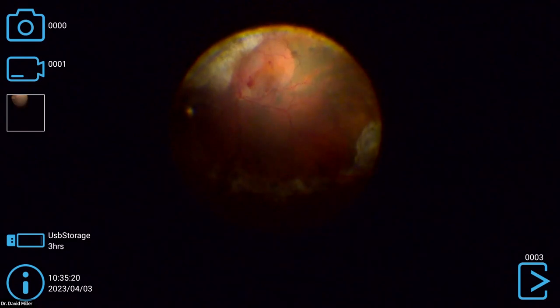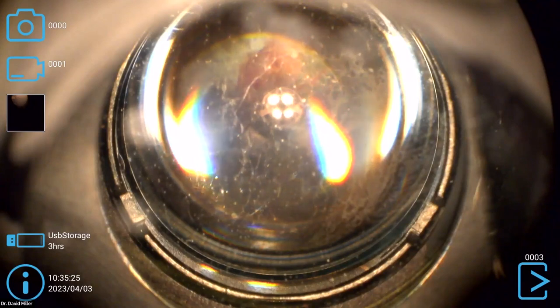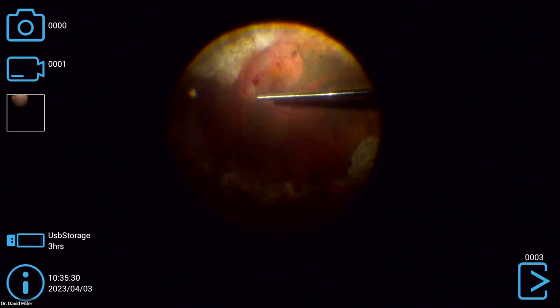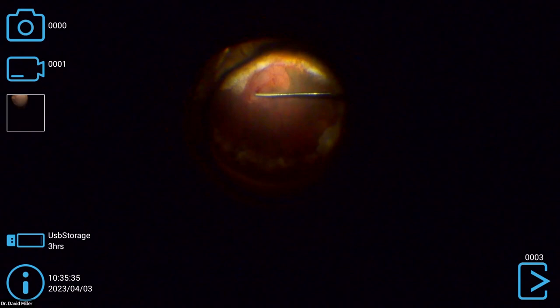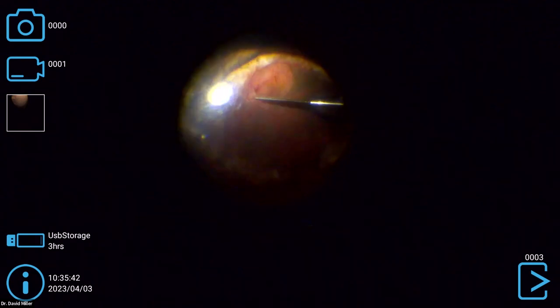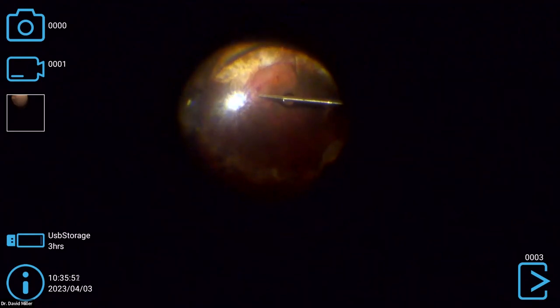So we're going to put the air in and we're set. Air, then gas. Okay. And we'll grab the rest of these little fragments. 25. Okay. You're doing well, Eric. The scar tissue came out real nicely. The retina is remaining attached. I like how the scar tissue came off the macula, peeled out very well, and relieved all the traction.